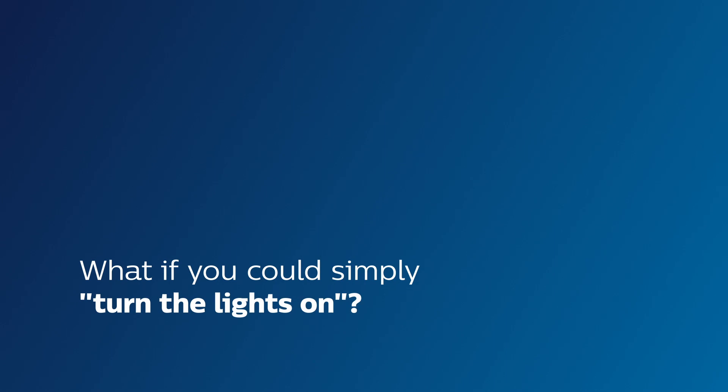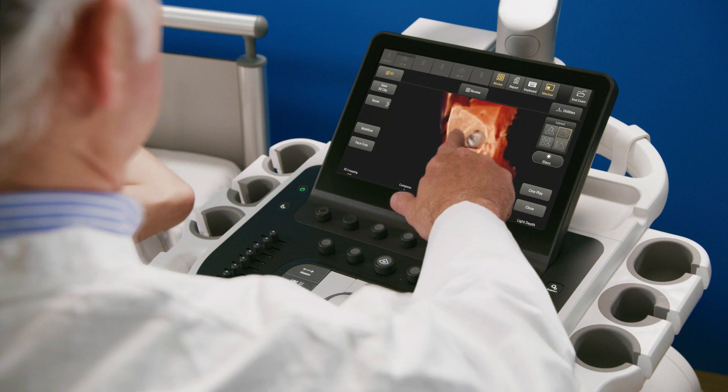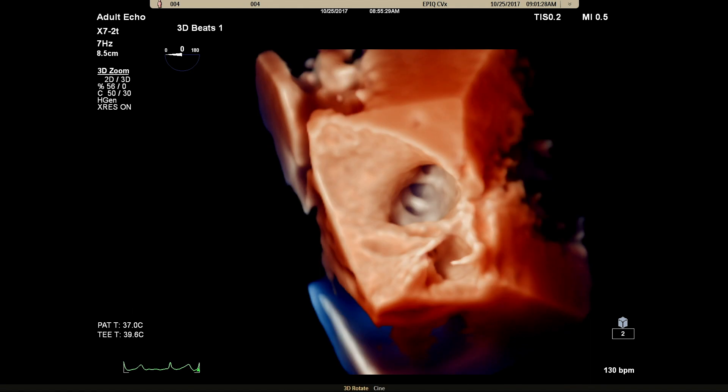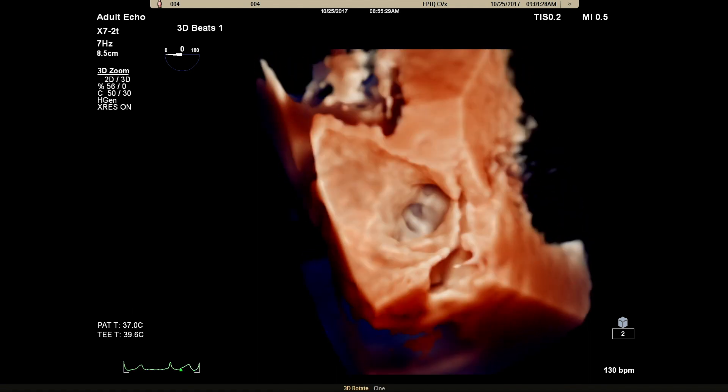What if you could simply turn the lights on? Philips Epic CVX with Cardiac TrueView brings realism to your images like you've never seen before. Photorealistic 3D rendering can make it easy for you to interpret what you're seeing and reach a better overall understanding of the cardiac structure.